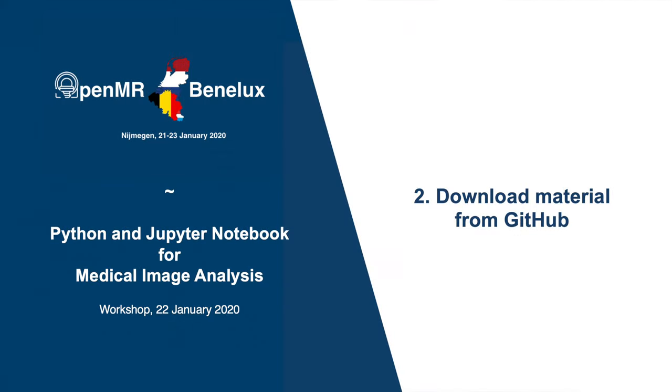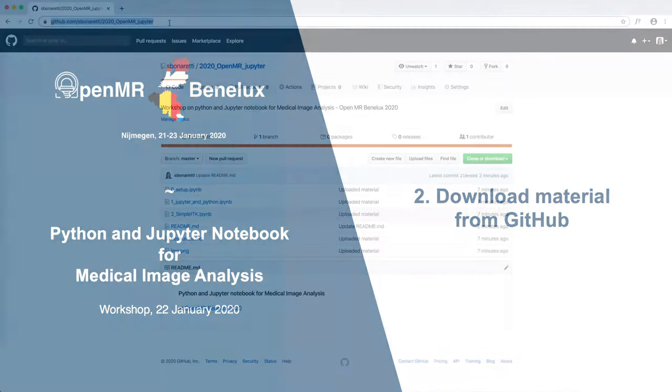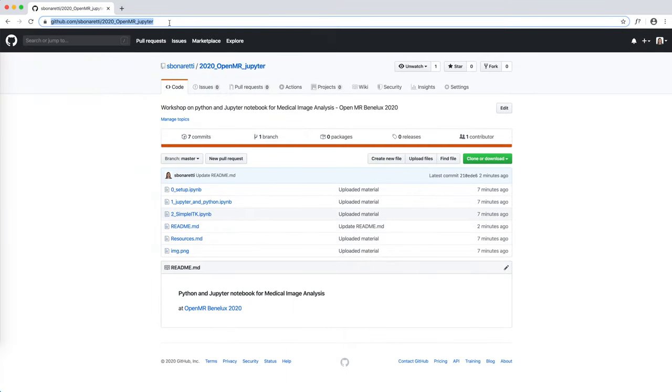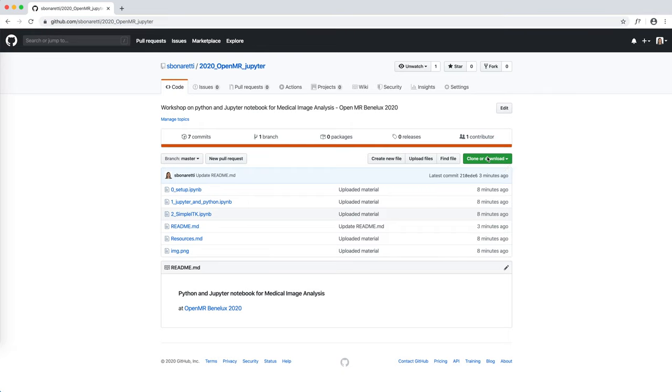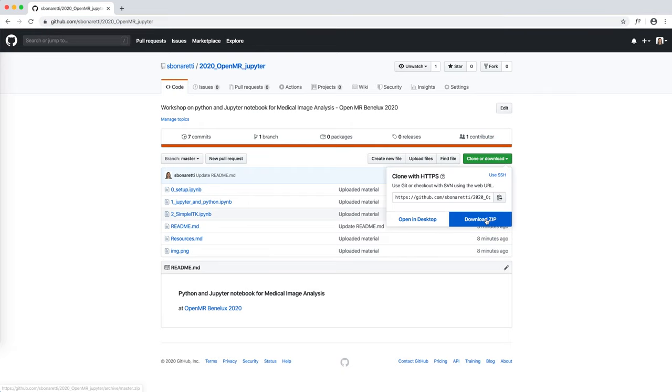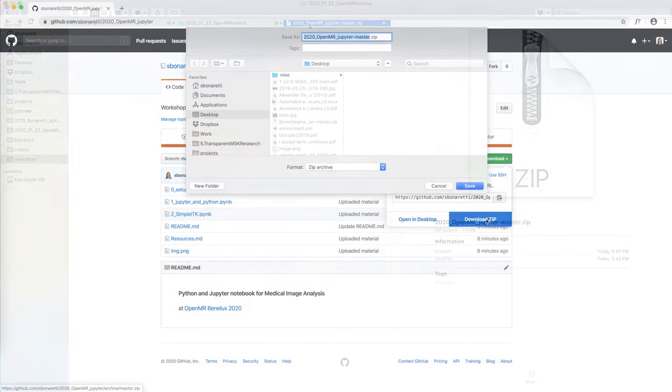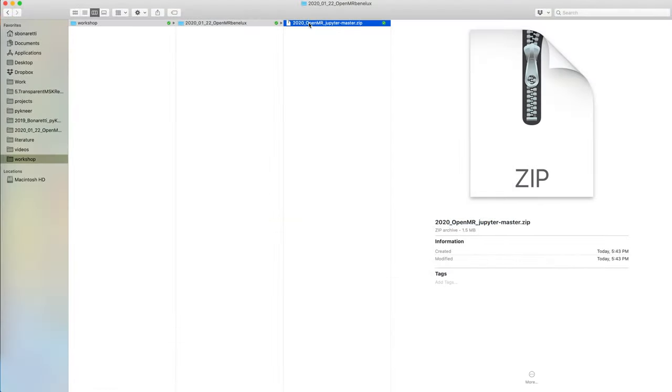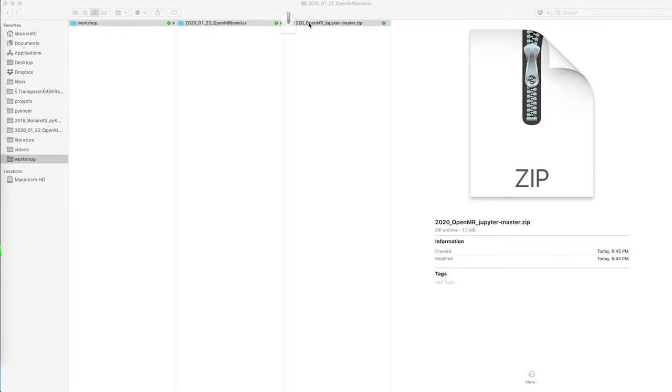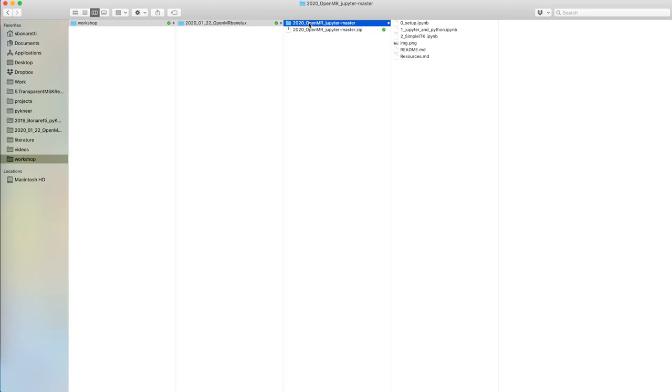The second thing to do is to download the material from GitHub. Go to github.com/sbonaretti/2020_openmr_jupyter. You will clone or download and then download zip. Download the files in a folder of your choice. Once downloaded, unzip the files.